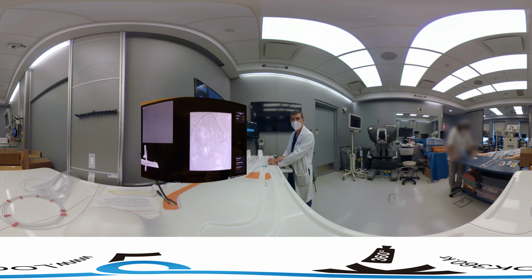And what we're trying to go for is near stasis, so either static within that branch for 5 heartbeats, or stasis. So now you can see that we're getting pretty sluggish flow here. So we're going to let it settle out. And you can see that's getting very, very slow. You're going to start seeing staining of the fibroid uterus soon. So there you can see a little bit of staining of the fibroid uterus.